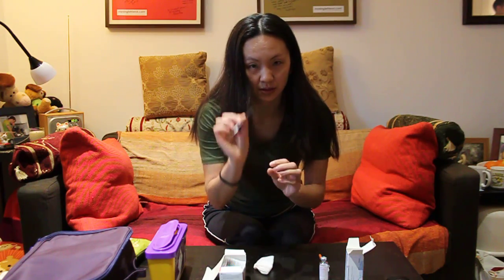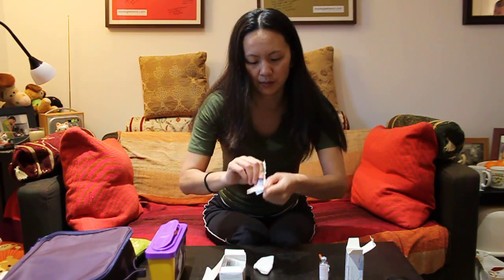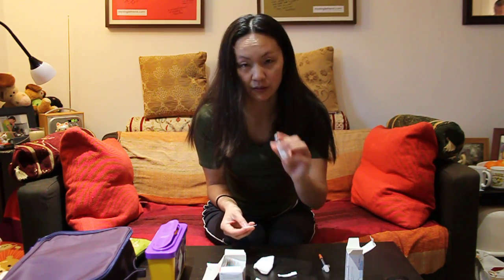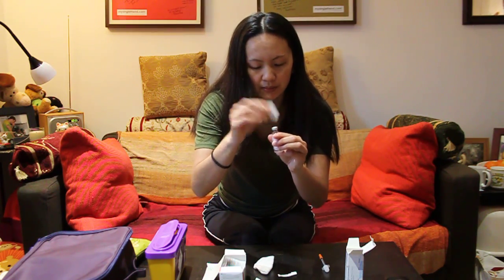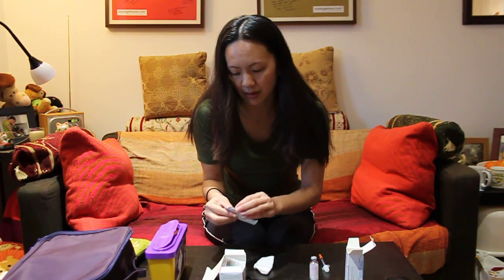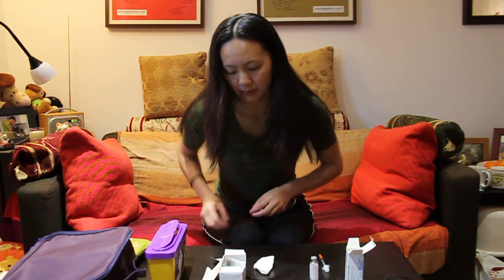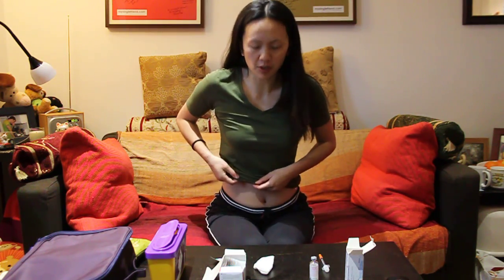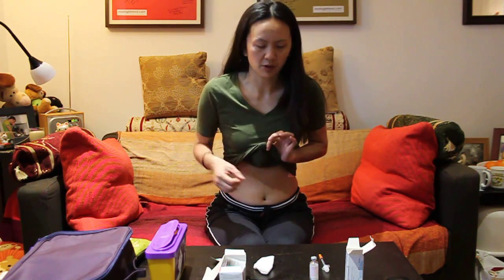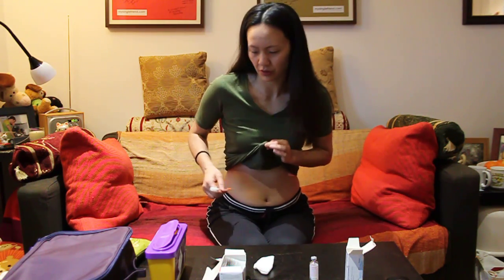First thing, you need to get your injection swabs. Open one up, get your vial and clean the top of the rubber — that's it, done, nice and sterile. With the second swab, you need to clean your skin area. I'm wearing a very close-fitted top. Some people wear loose tops, but the problem is you have to hold the top and try to inject at the same time, which is really not good for the first few times when you're trying to concentrate on injecting.